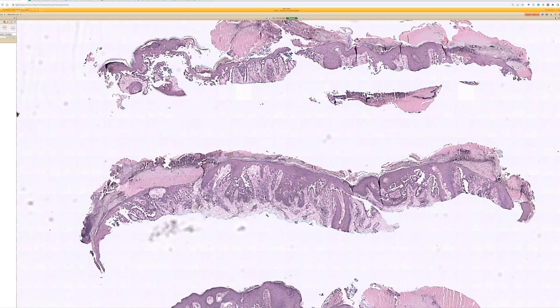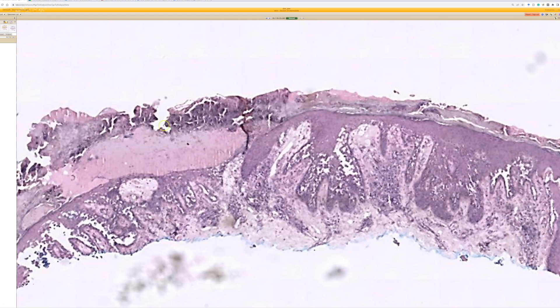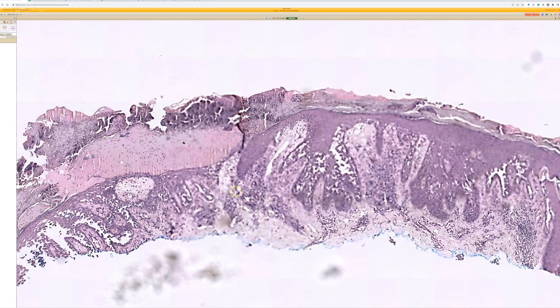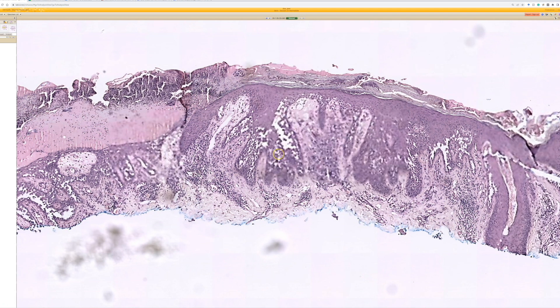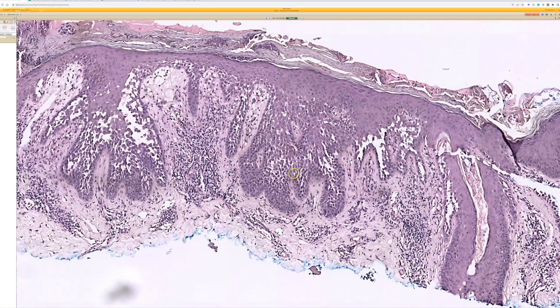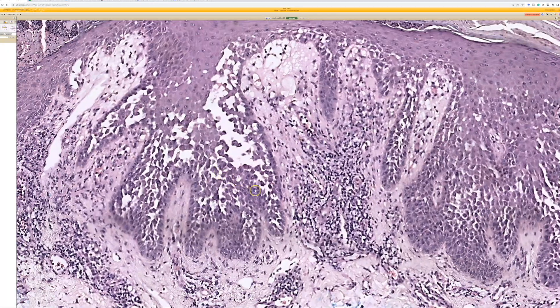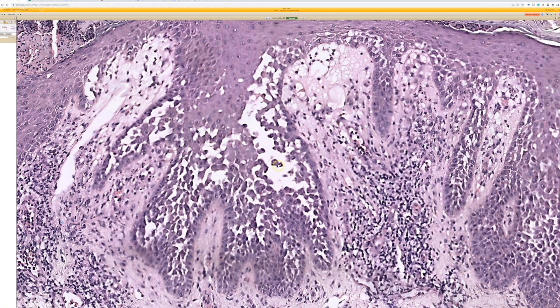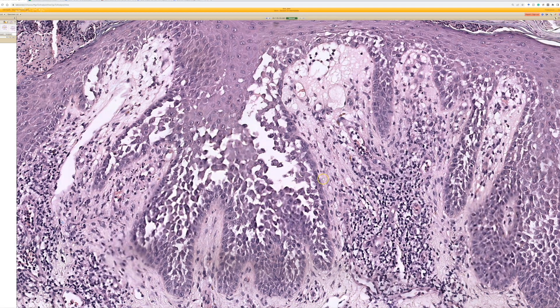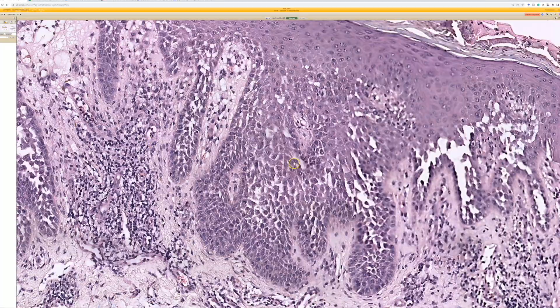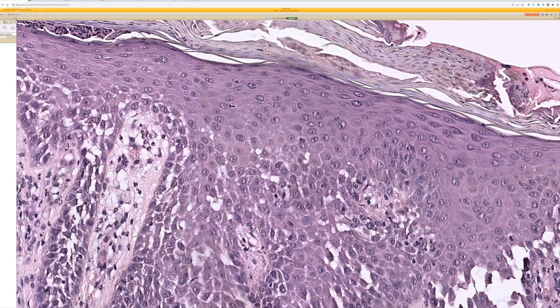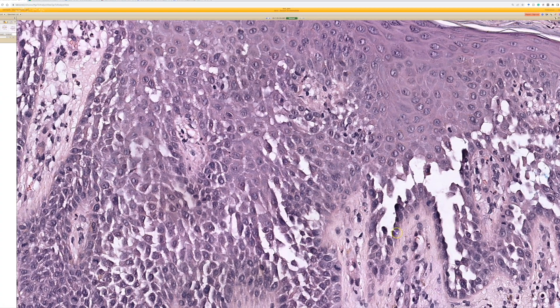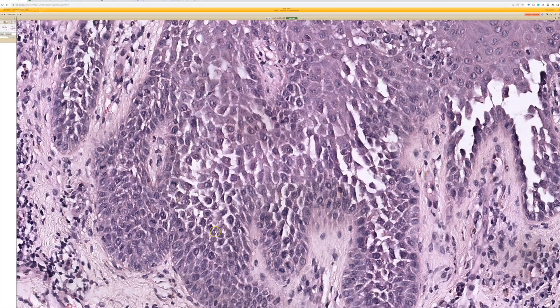In addition to abundant scale crust and serum, the epidermis appears to be falling apart. It could look like spongiosis at first glance, but in other areas we can see actually detached keratinocytes with rounded edges — that's acantholysis. It's important to keep in mind that acantholysis and spongiosis can have overlapping morphology microscopically; you might initially just think of spongiotic dermatitis. But once single cells start coming loose, rounding up, and floating in the space, that points toward acantholysis.